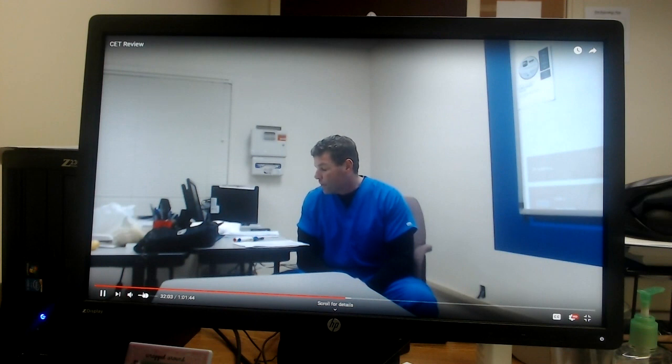61, a technician is performing a 12-lead EKG and notices the patient's heart rate is 44 beats a minute. Which of the following does this heart rate reflect? Bradycardia, good. Which of the following waves represents atrial depolarization? P wave, good. A technician is giving instructions to a patient on the use of an ambulatory monitor. Which of the following statements by the patient indicates an understanding of the teaching? That would be, I will check the monitor's green light. That just means all systems are go, right?